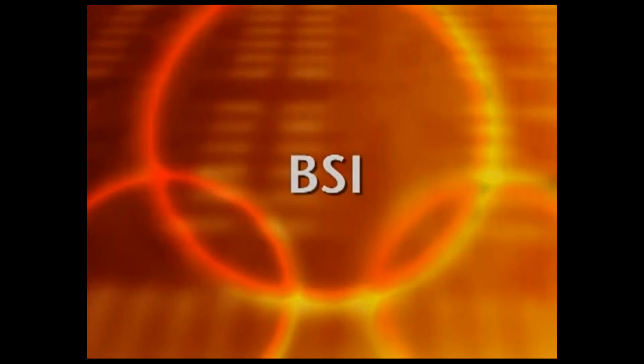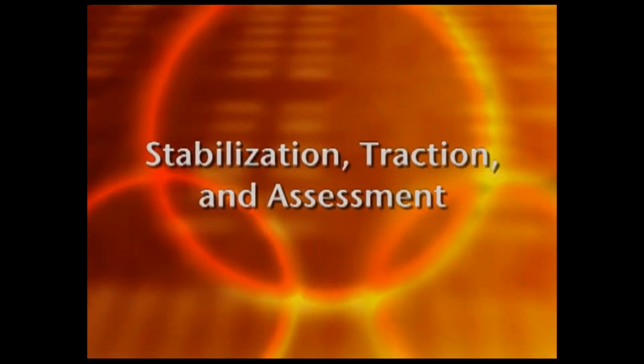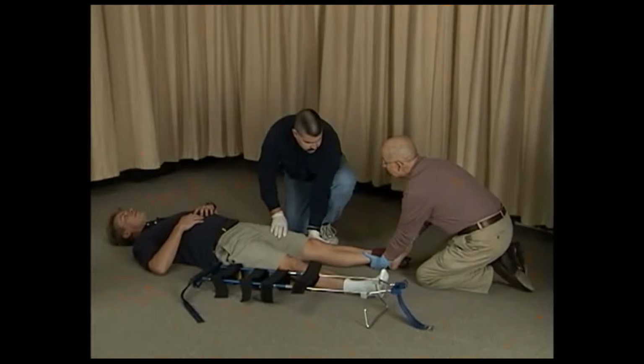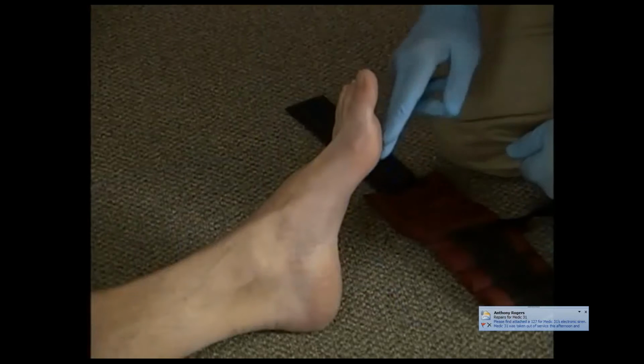Begin the station by indicating that the proper personal protective equipment is being used. I'm going to take proper body substance isolation precautions. Working together, apply manual stabilization and manual traction to the injured leg. Assess for motor, sensory, and distal circulatory function. I'm going to move to stabilize the extremity and direct my partner to check pulse, motor, and sensory function in the distal extremity.